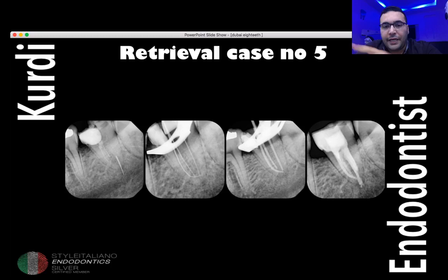And here you can see the file when I removed it, patency, master cone, and here is the obturation. And once I removed the file, once I made the obturation, once the anesthesia went out from the patient, she felt no more numbness, and it was very pleasant for her, and she thanked me in her own way.